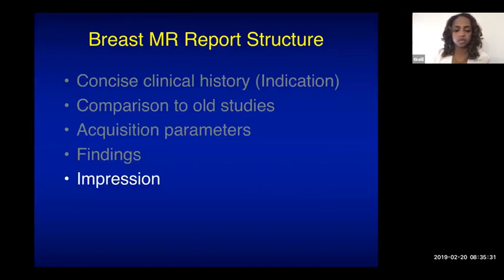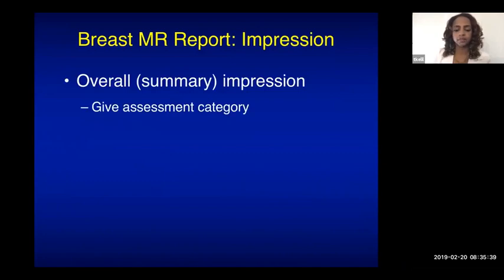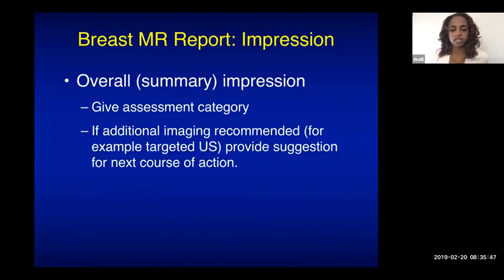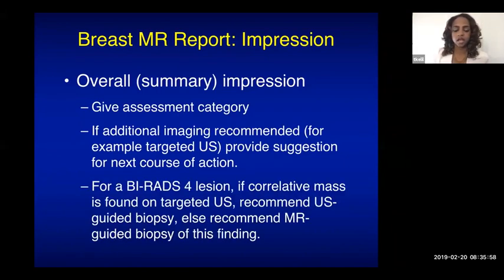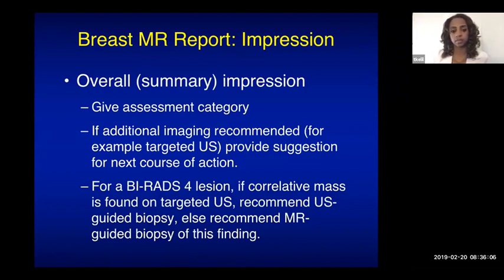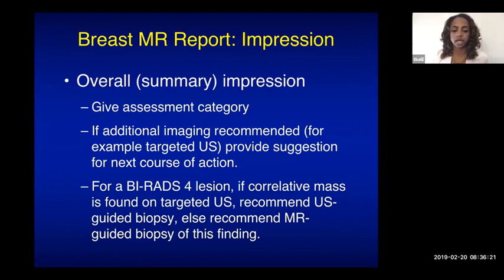The impression is your overall summary given to the clinician, including a BIRADS assessment category. For a suspicious lesion, recommend a second-look ultrasound before going directly to MR-guided biopsy, since ultrasound-guided biopsy is more comfortable for the patient, less expensive, and more readily available. If there is no sonographic correlate, proceed to MR-guided biopsy.